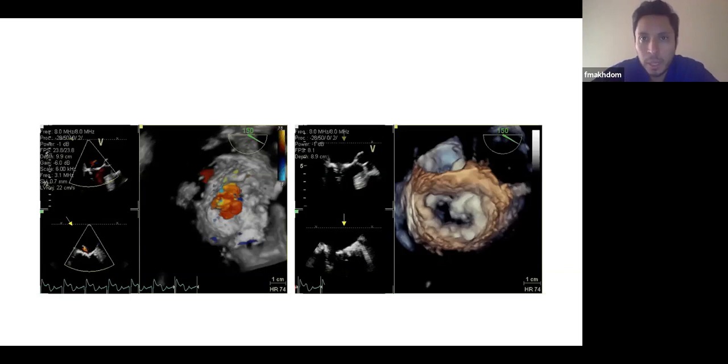There's more experience with mitral valve in valve, so degenerative mitral valve prostheses, but valve in MAC as well is an option. The outcome of any of these options is actually very poor.